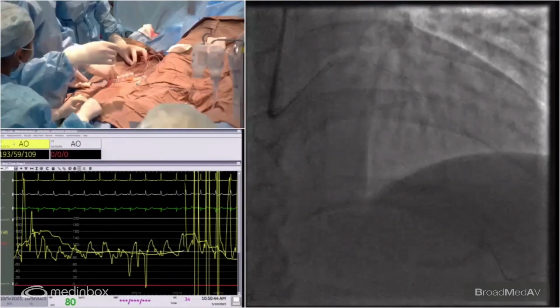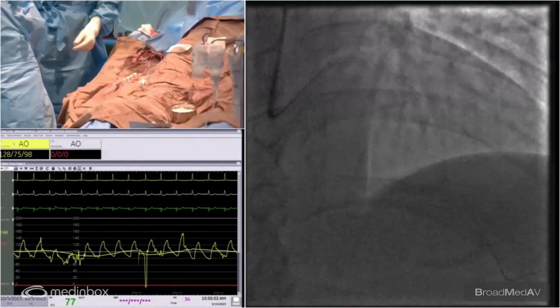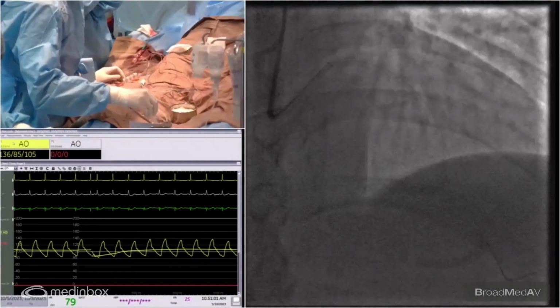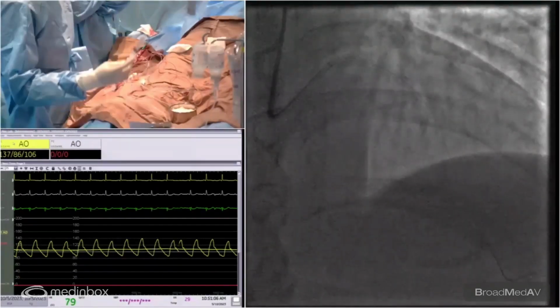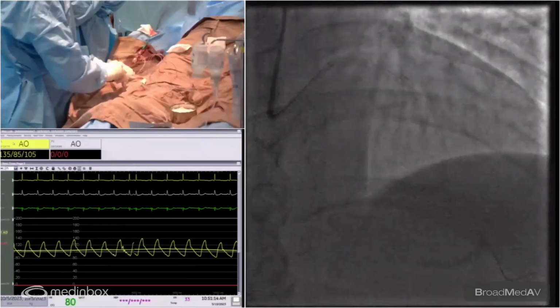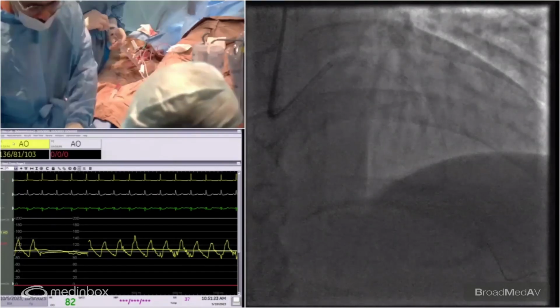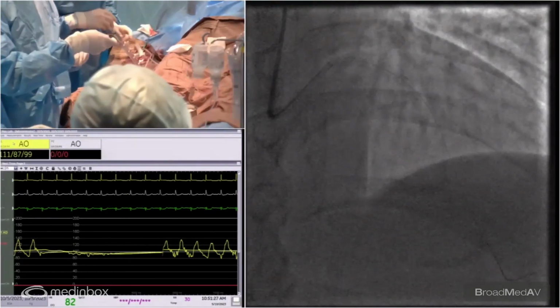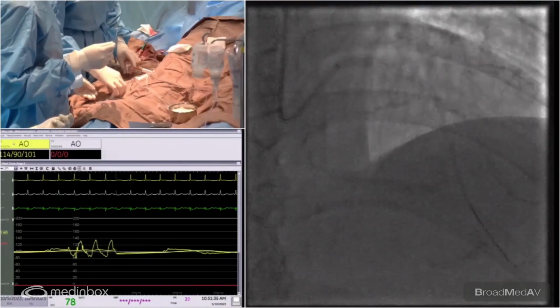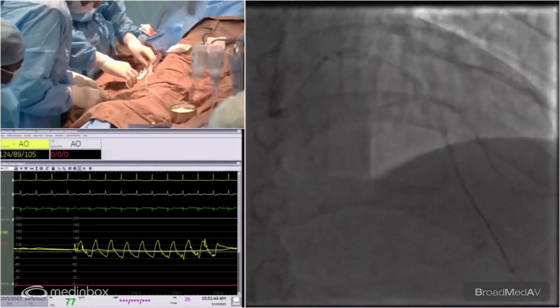So when you do an in-stent restenosis, the most important thing is imaging, and we image for 3 reasons. It is to know what is the reason for the in-stent restenosis. The reasons for in-stent restenosis are either an under-deployed stent during the first procedure. The second is a geographical miss, either pre or post lesion, where you moved and landed the stent, especially when you have plaque burden which is high in the proximal or distal part of the stent deployed. And finally, the third reason is when you get accelerated atherosclerosis or neoatherosclerosis within the stented segment. Now, the best way to image in-stent restenosis is definitely OCT, because it gives you all the important messages that are required for deciding what next to do.